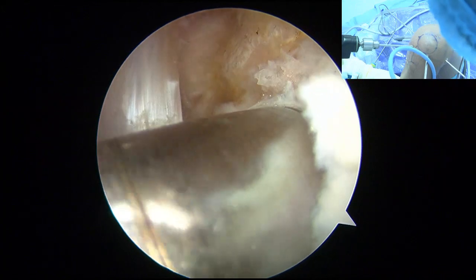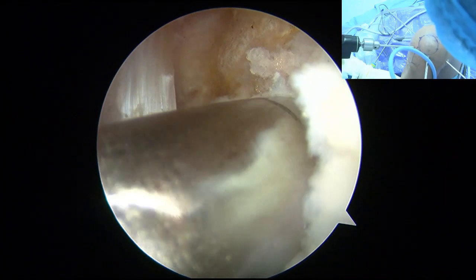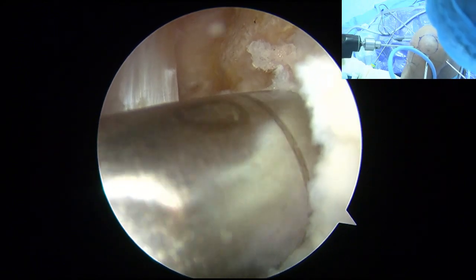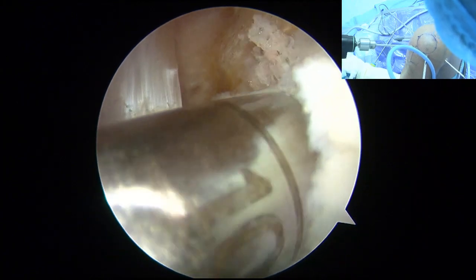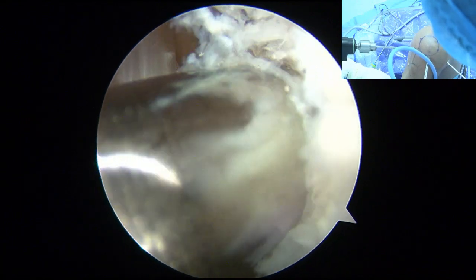So we go in about 20 for these patients. Okay, we have long size. Our gap is 8. It's long enough. Okay, this is 15. This is 20. Okay, 20 is fine. And always start with the small size first. This is number 6, but actually our tunnel is number 9.